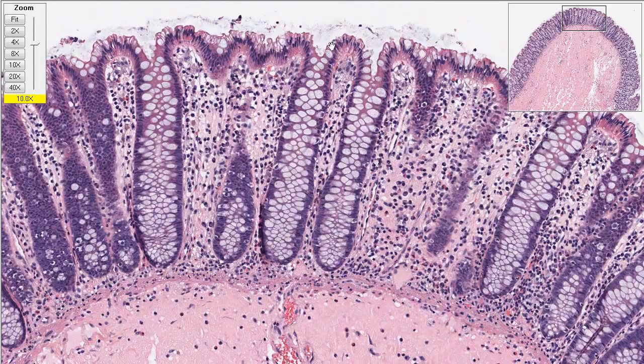And then when you look at it, it has architecture in which these are glands. They're like test tubes sticking down. And the purpose is to increase the surface area. And the term gland, you hear it a lot in medicine, it's just any structure that's containing fluid and can release the fluid. What is a gland? A gland is an epithelial structure, so it's made of cells that are packed tightly, and the cells have a top and a bottom. And then they're formed into some sort of infolding or structure so that there's a middle and then there's an outside to that structure.